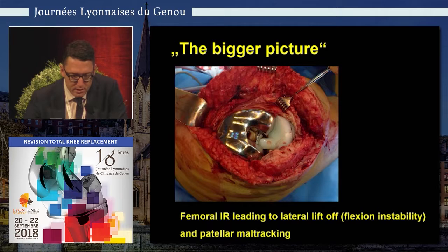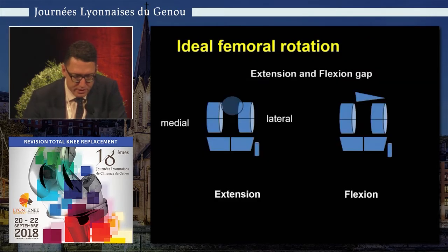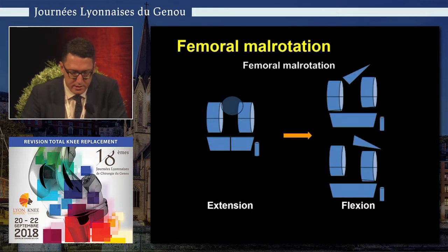So what I'd like to do is go through all these landmarks, and then we see what is actually the best landmark to use, and that's our recommendation. So the ideal femoral rotation, we know, should be like this. You have the balanced flexion and extension gap.